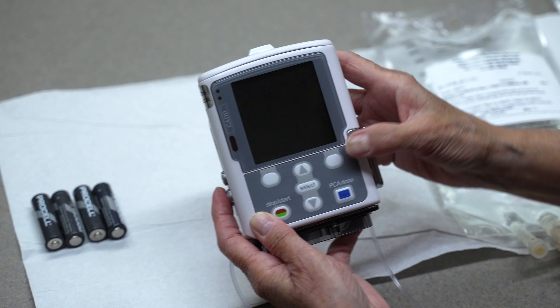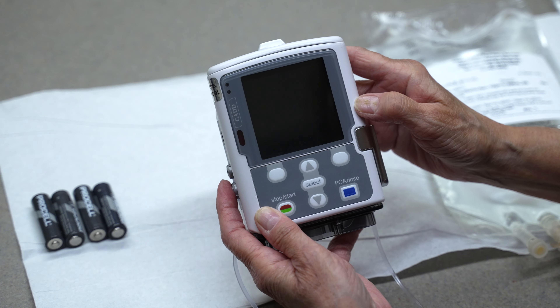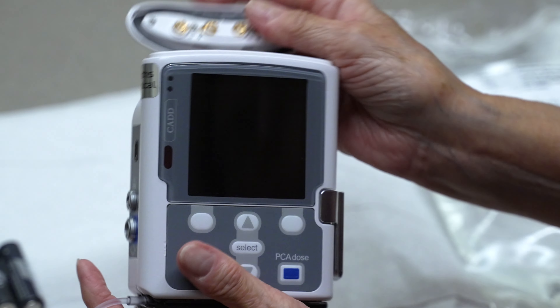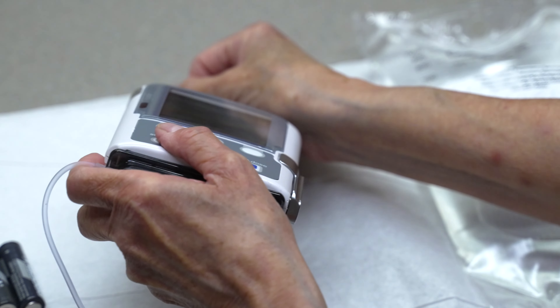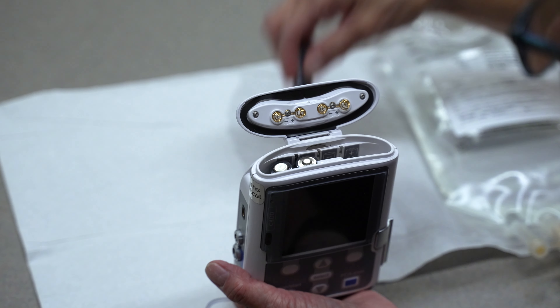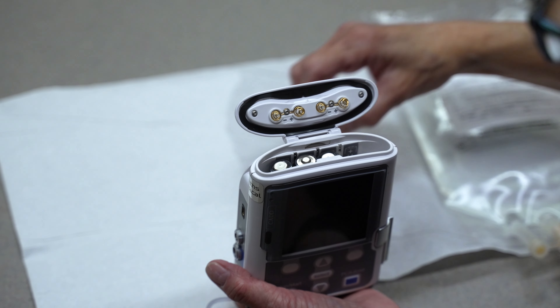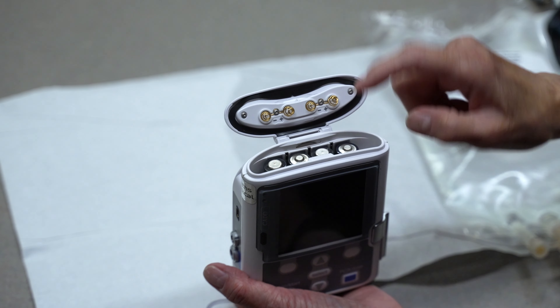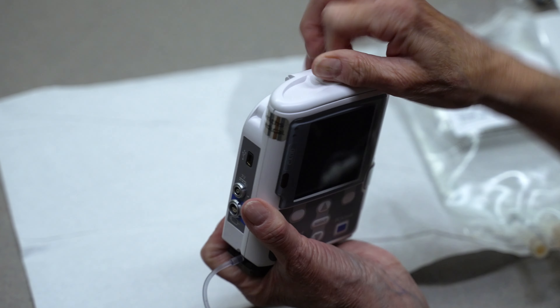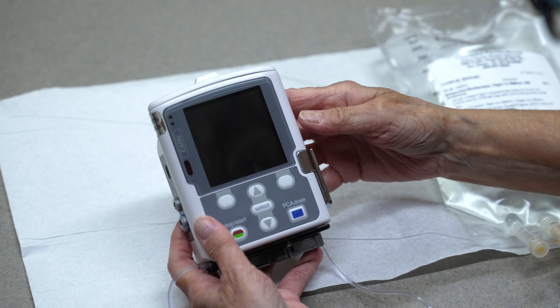To open the battery door on the top of the pump, turn the knob counterclockwise. Hold the pump at an angle to carefully remove the old batteries. Insert four new AA batteries. Be sure to match the positive and negative markings on each battery with the same markings on the pump. Close the battery door and turn the knob clockwise to lock it.